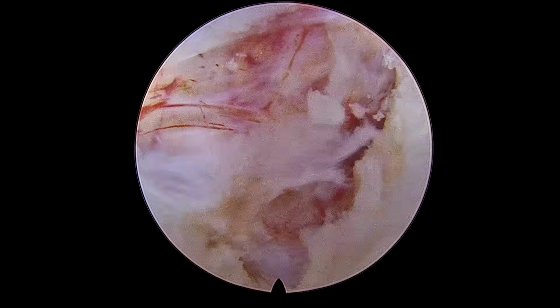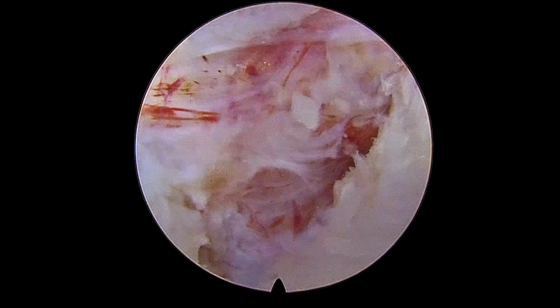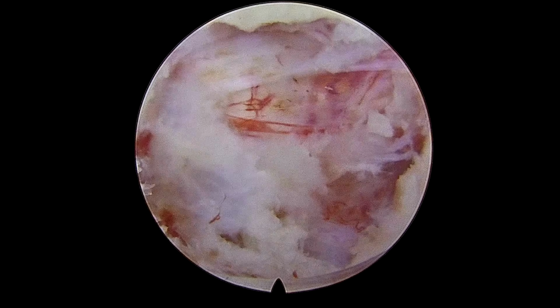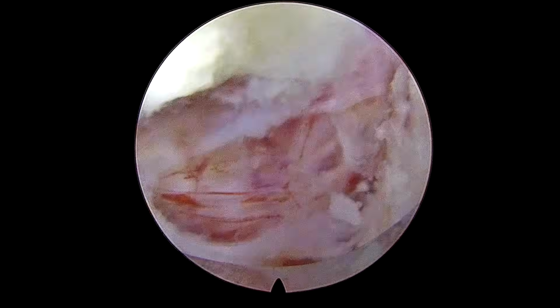So once I finish my bony work, I'll try to remove that epidural membrane, and then your nerve roots and the dura will be exposed. Sometimes this epidural membrane becomes adherent to the dura. So while pulling the epidural membrane, be careful.